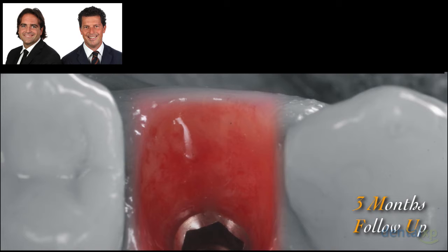And this is the scenario that you want to see when you unscrew the temp for the first time. This is the 3-month follow-up, and you can see how thick and robust the tissue is and how the implant has been positioned in the correct way. You can see that you have a good vertical soft tissue height, which is critical for the long-term prognosis and survival of your restoration, and also for its aesthetics, because you want to give space to your technician to create a nice emergence profile for your final crown.